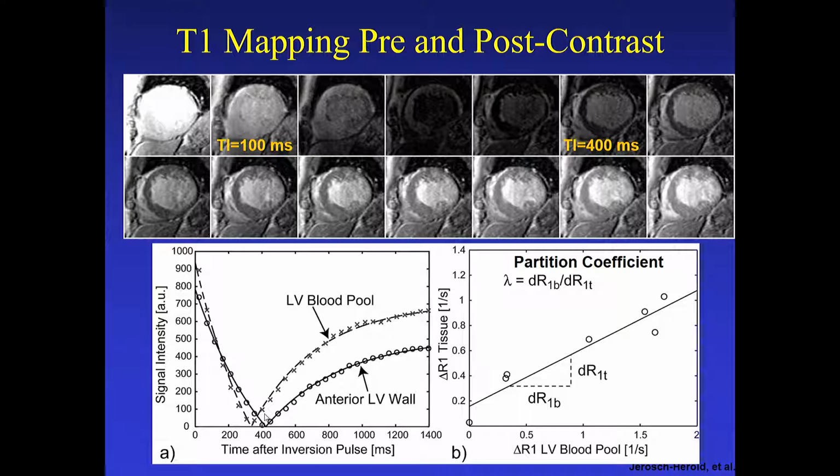One of them is known as T1 mapping. T1 mapping is fairly similar, except instead of seeing the T1 enhancement, it is actually quantifying the exact amount of enhancement. Weighting means you basically compare one structure to another, so it's just relative terms. But when we look at mapping, you're quantifying the curve, the actual values of T1.